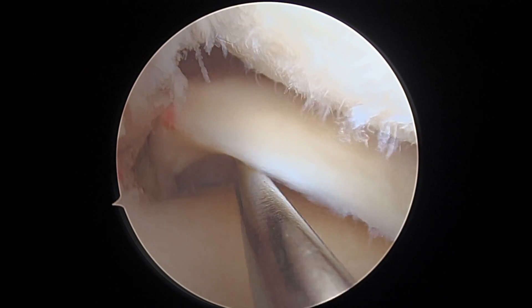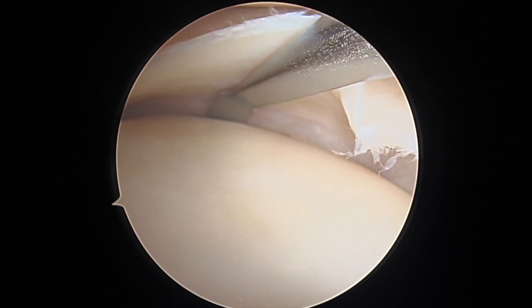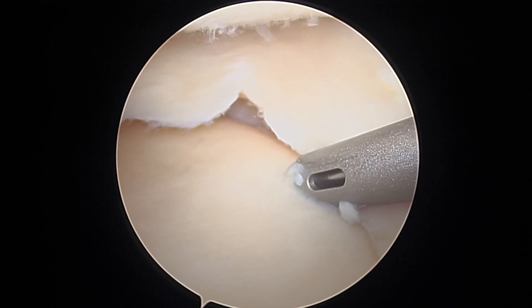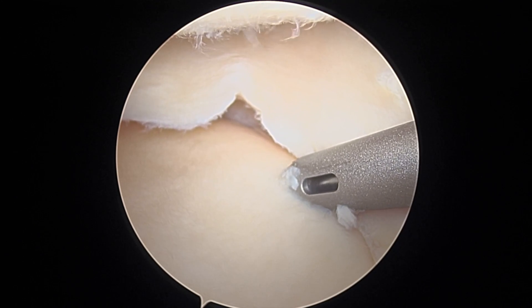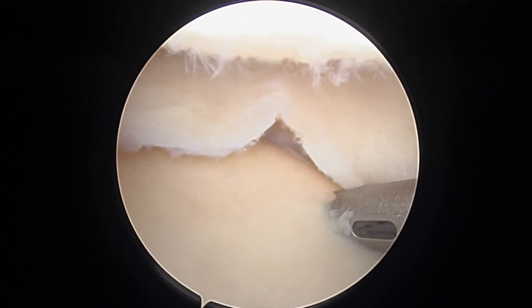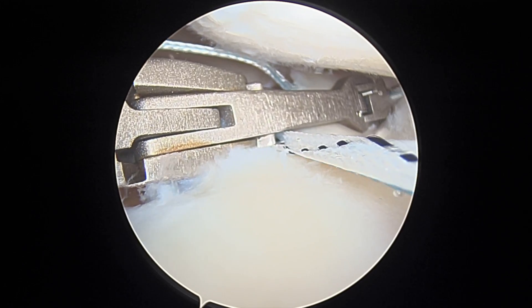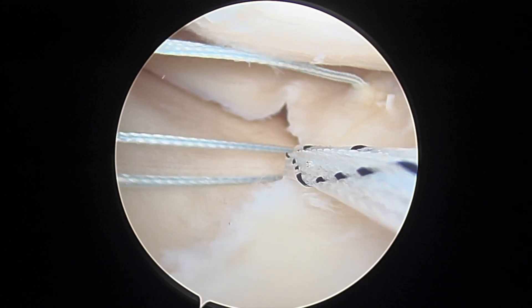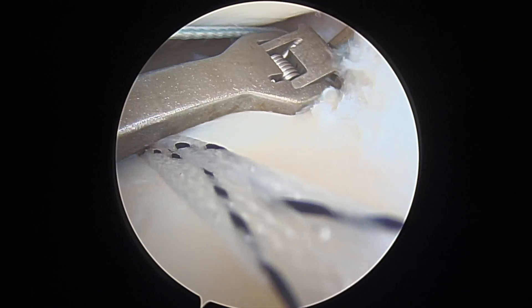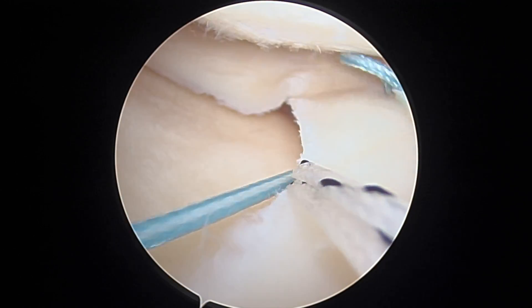Here's the meniscus root avulsion. Because it's chronic, we'll use a Bankart elevator to elevate at the meniscotibial junction, essentially elevating the meniscotibial ligaments. The fiber tack is then inserted — this is going to be our centralization stitch — and is placed adjacent to the articular surface. We then pass the repair stitch through the meniscus, and also place a shuttling stitch to then place this repair stitch in a mattress fashion.